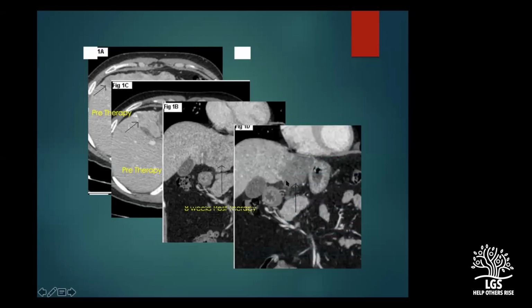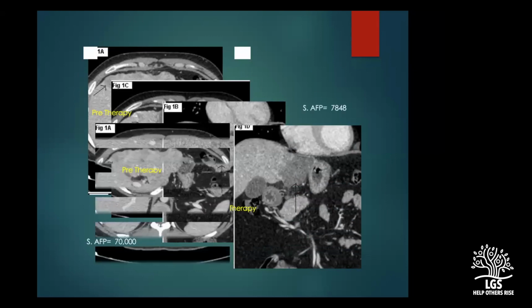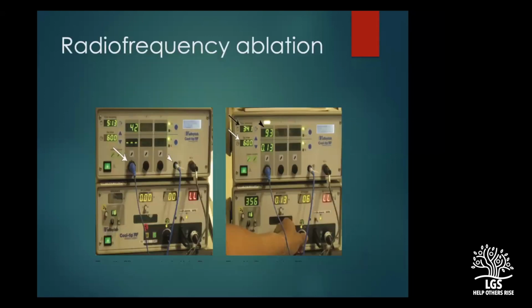So this is one such case, and this was 8 weeks post-therapy. You can see that you no longer see the tumor there, and his AFP just fell down. It was 70,000 to start with, and I think it came down to 7,000.